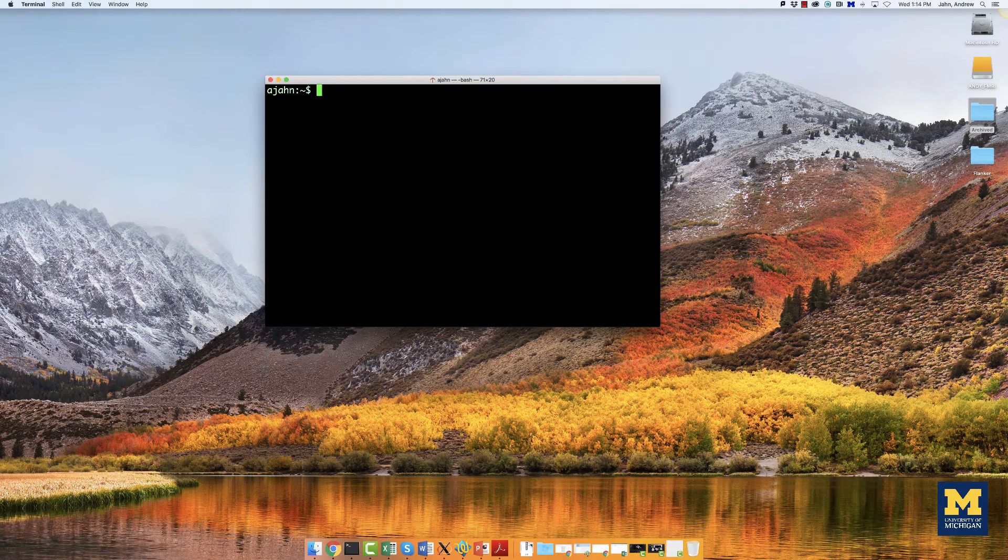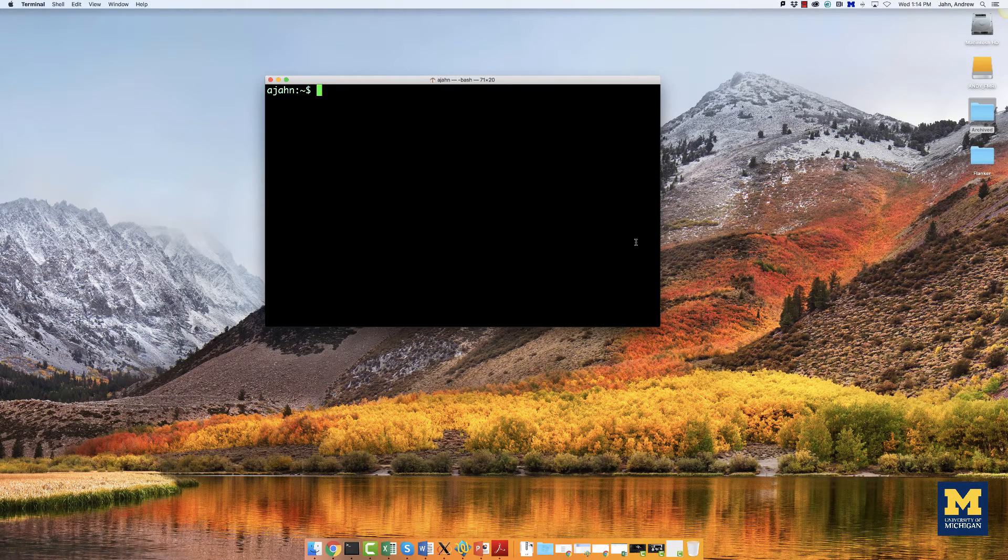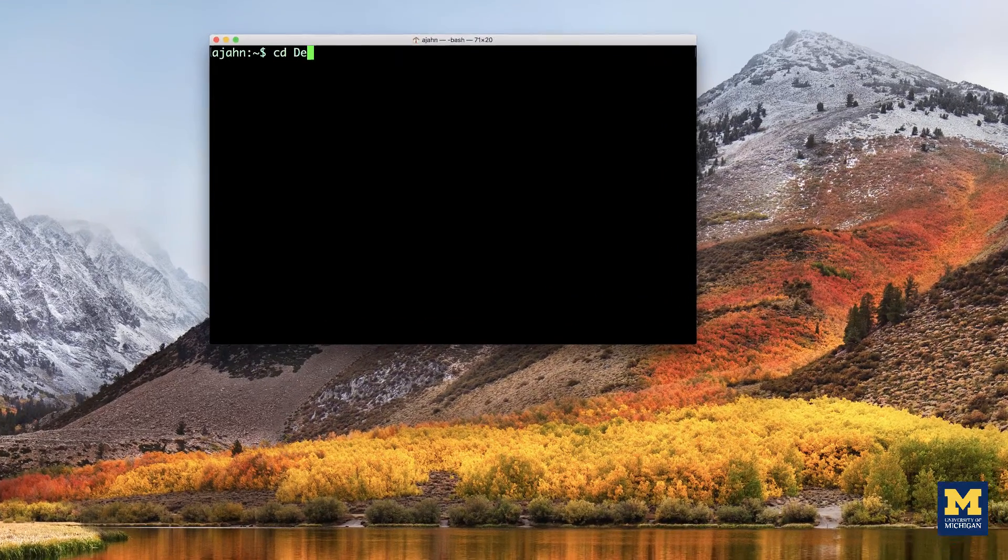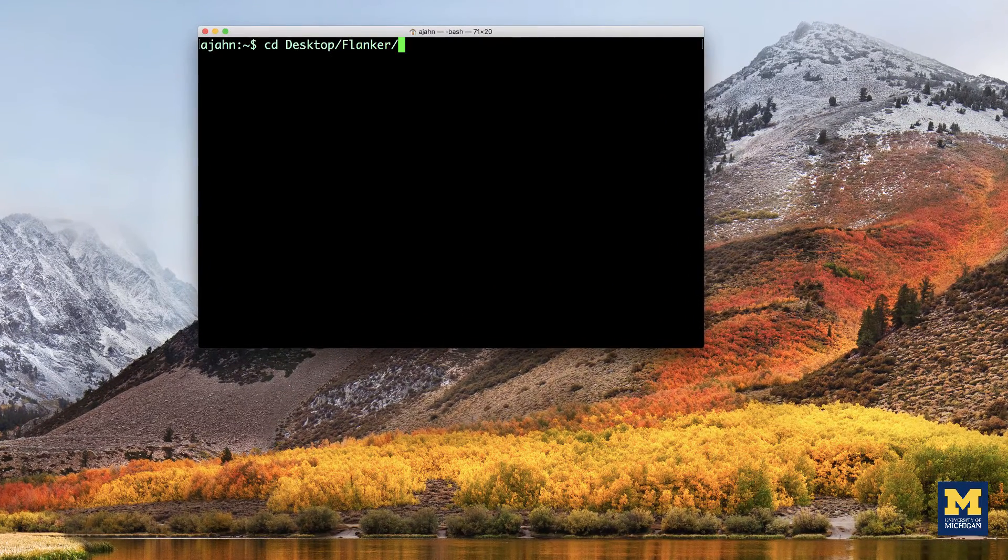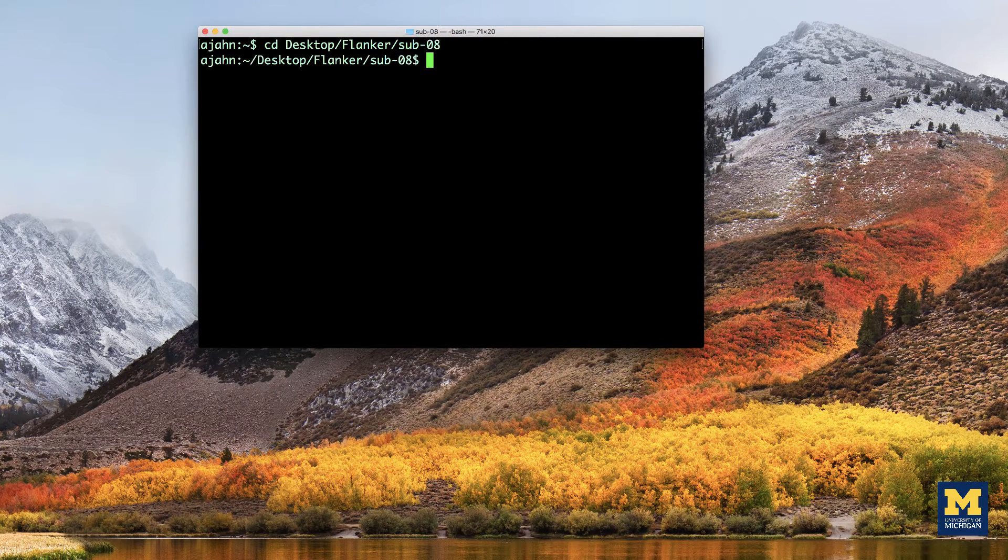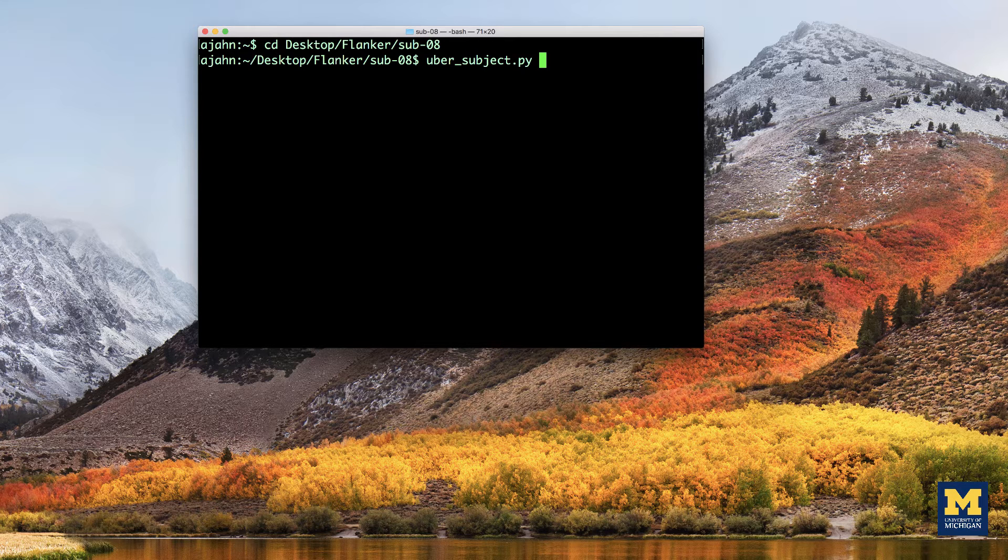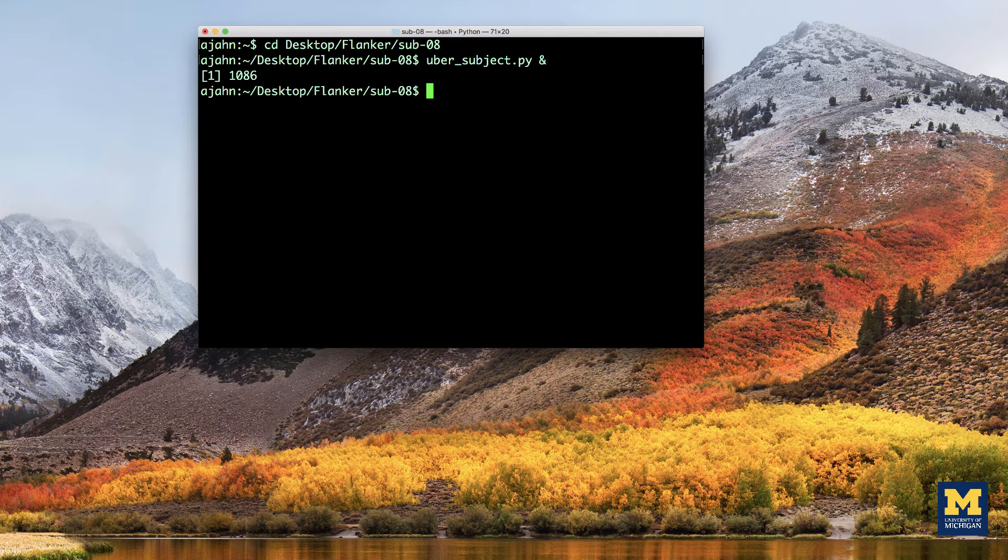To see how it works, first navigate to the sub-08 directory. From there, type uber_subject.py, then an ampersand, and press return.